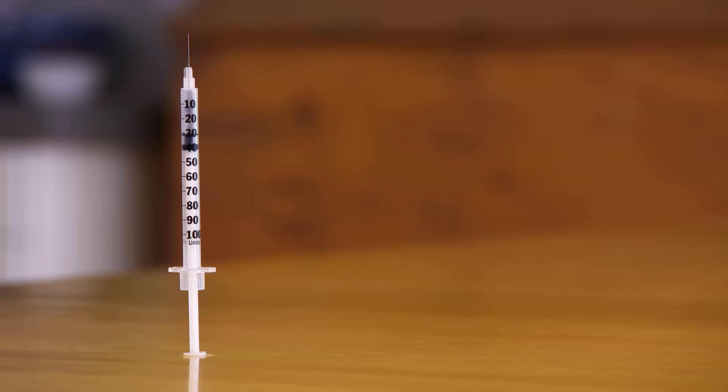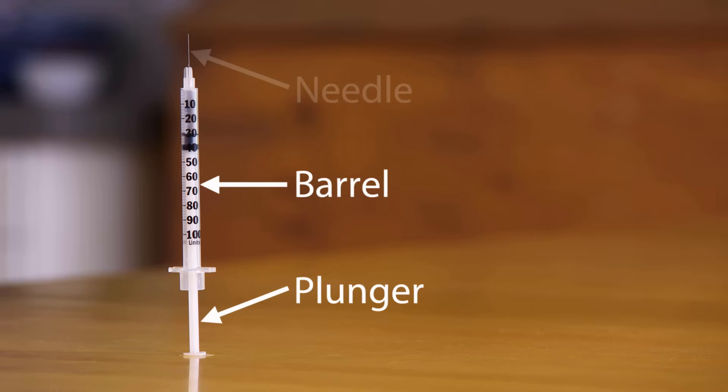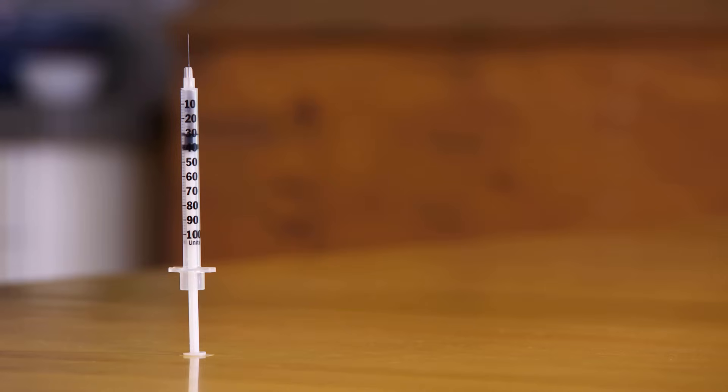The syringe is made of three basic parts: a barrel, a plunger, and a needle. The barrel has markings on the side that help you measure the right dose. Insulin syringes, like this one, are normally marked in units. Other syringes may be marked in milliliters. Your doctor, nurse, or pharmacist will show you how to use the markings on the syringe you have.